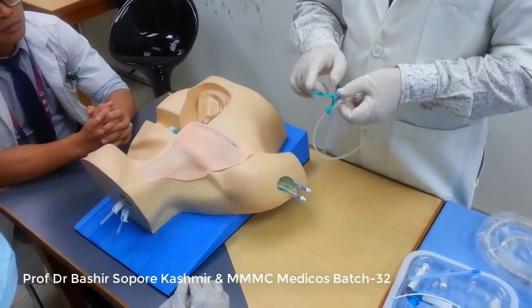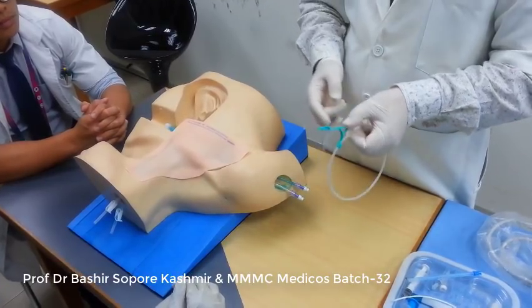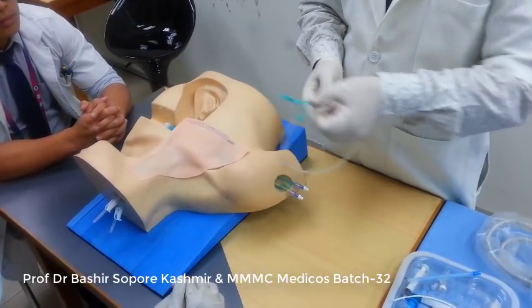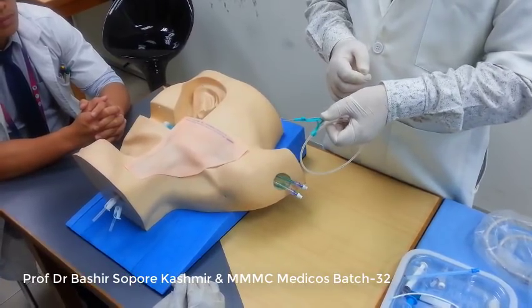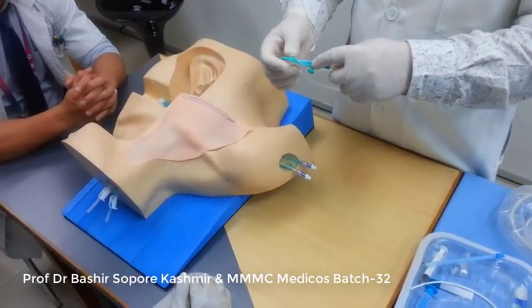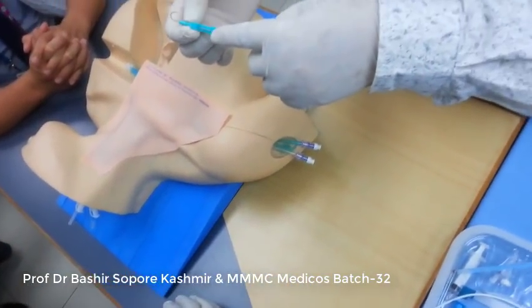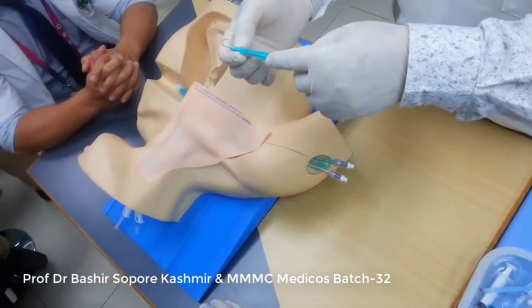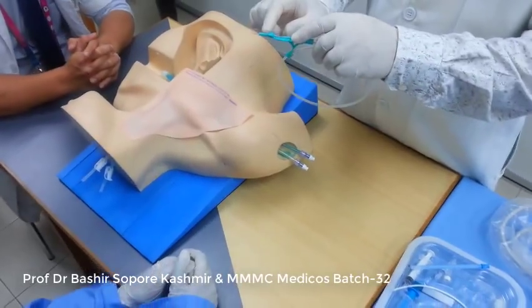But this J-shaped guide wire, you see, this kink cannot pass through the needle. Can it pass? It can't pass. So it has to be straightened. How will it be straightened? So this guide wire has another part here. This is called the sleeve, straightener, or the straightener sleeve, this part.